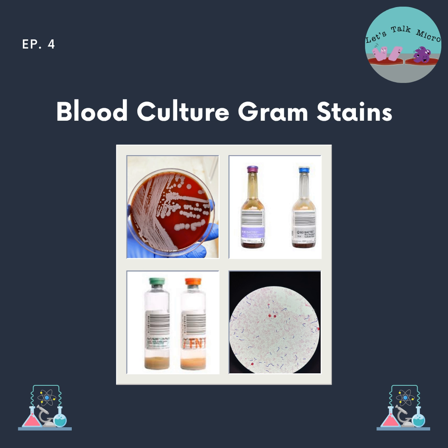Then what are we looking for when we have a gram stain? We are looking for cellular elements such as white blood cells, specifically PMNs. Do you know what PMN stands for? Polymorphonuclear neutrophils. So these are the segmented neutrophils or segs. So now you know that when I mention the term segs, we refer to segmented neutrophils. Other cells that we look for are the epithelial cells. They're very important when we're working with a sputum sample, but we'll talk about that down the road.